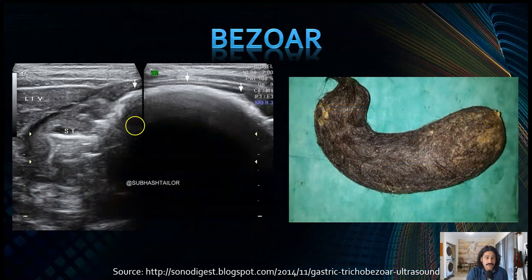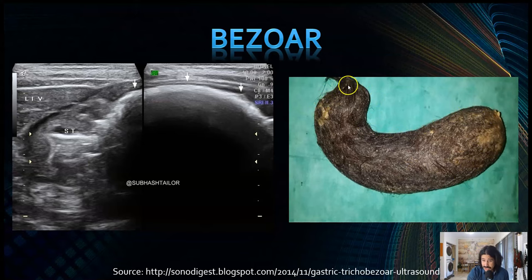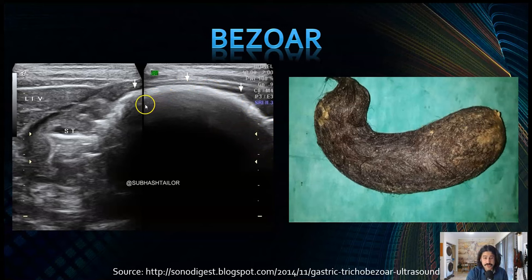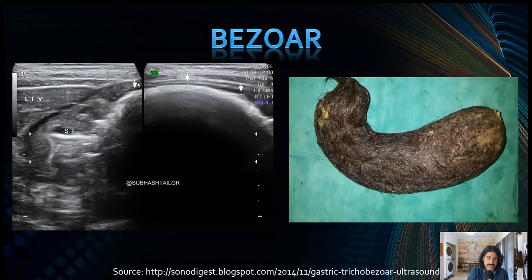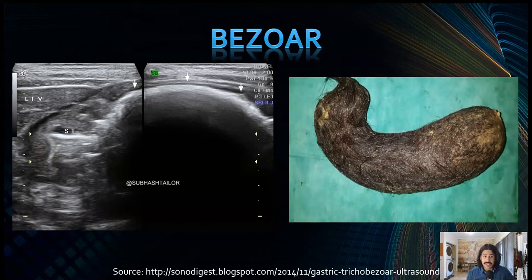Here's a case of a trichobezoar — you can see it's taking the shape of the stomach. On ultrasound you see this echogenic material with dirty shadowing, and a little bit of the liver, with the stomach going into the pyloric region. Obviously history can help: if you know the person has trichotillomania, that can help in the diagnosis of this condition.